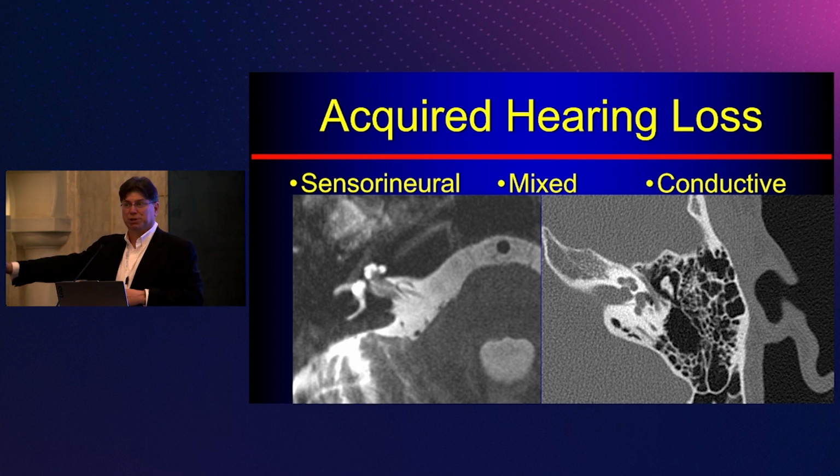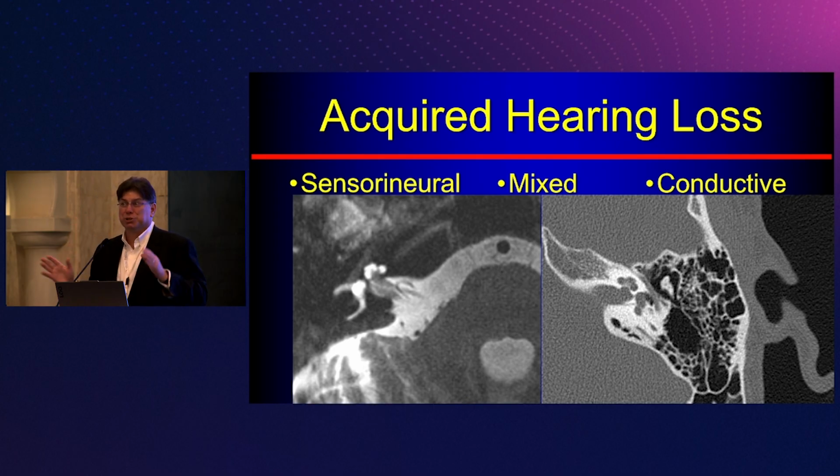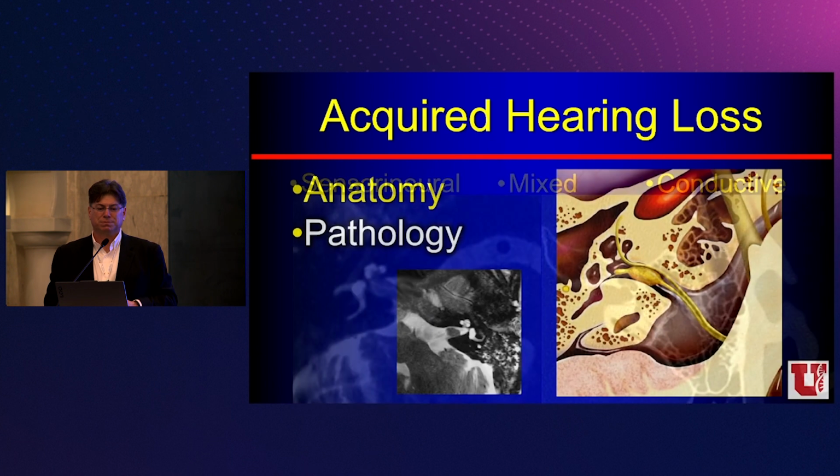If they say conductive hearing loss, I'm doing a CT, and I'm going to keep looking till I find something. If I don't find anything definite, I'm going to say, this suspensory ligament looks a little thick. I'm most suspicious of that. And how the neuro-otologists actually evaluate doesn't sound very scientific. They'll actually go through the TM and grab the ossicles with a pair of tweezers and wiggle it to see if they think it's fixated or not. So that's how they evaluate it. If they say sensory hearing loss, then I'm going to do an MR in those cases. So that's an important differentiator right at the beginning.